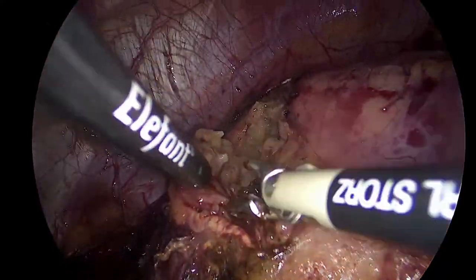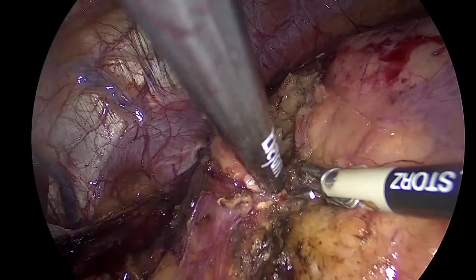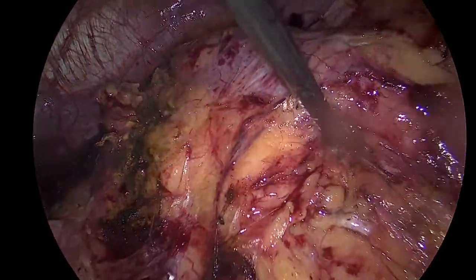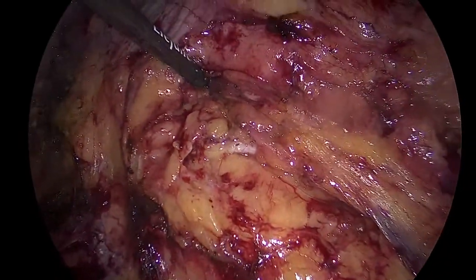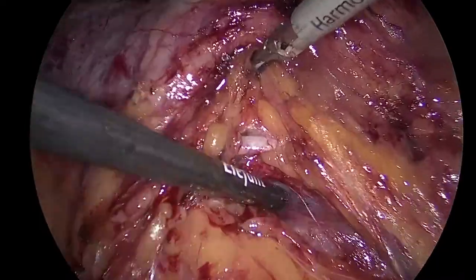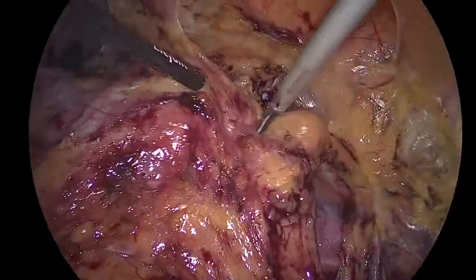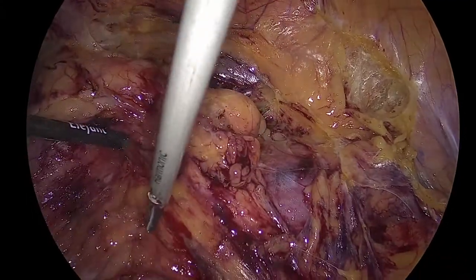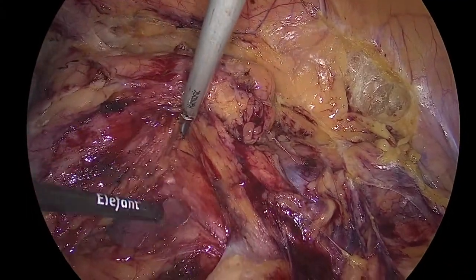No, it's very good, Evangelos. Okay, let's go back. It's very demonstrative dissection for the laparoscopic kidney surgery. Good. So, again, this is ureter here. Very informative. This is ureter. Now, come on the back here. Come on the back. Look what I was saying before. If you don't mobilize this stuff here, you're not going to be able to lift up your kidney nicely up there.